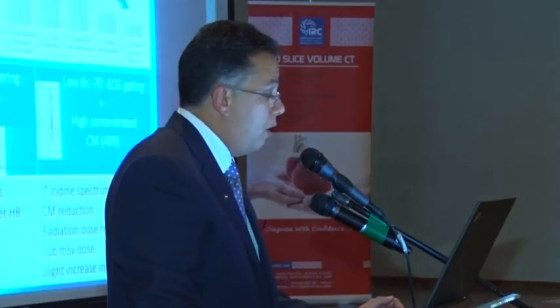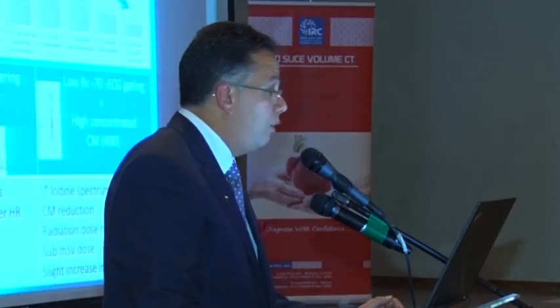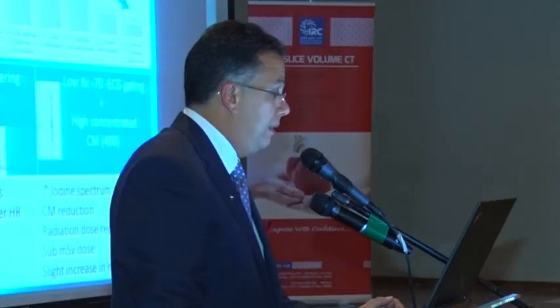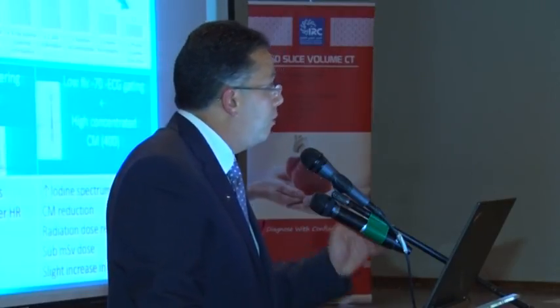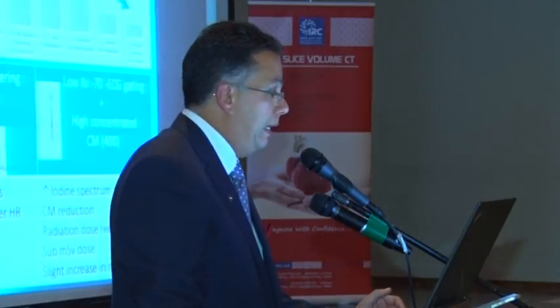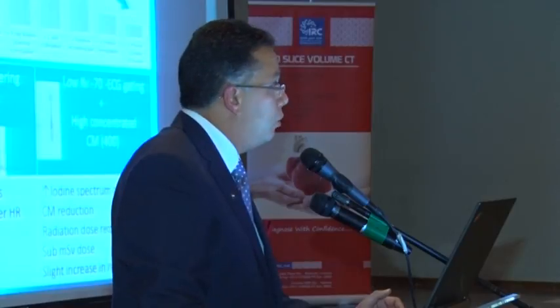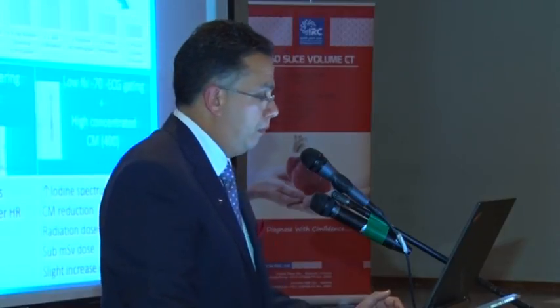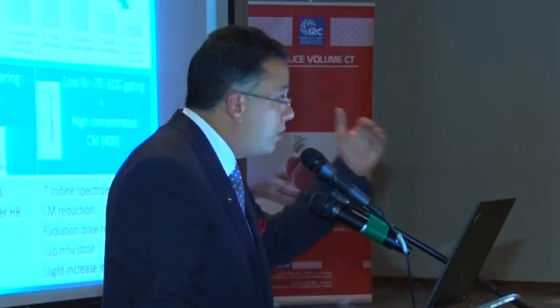Which is a technique giving rather high doses of radiation, 8 to 10 millisieverts. And we are still using this technique in patients having great arrhythmia, or in ICU patients when we want to scan a patient very rapidly. And 8 to 10 millisieverts is not a very elevated dose, and it is acceptable, especially in emergency situations. And this is achievable by new generation machines that are present now in the post-64 era.